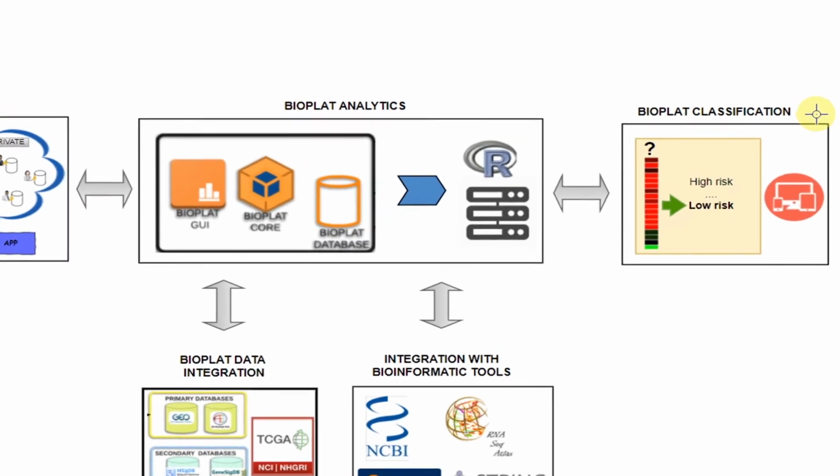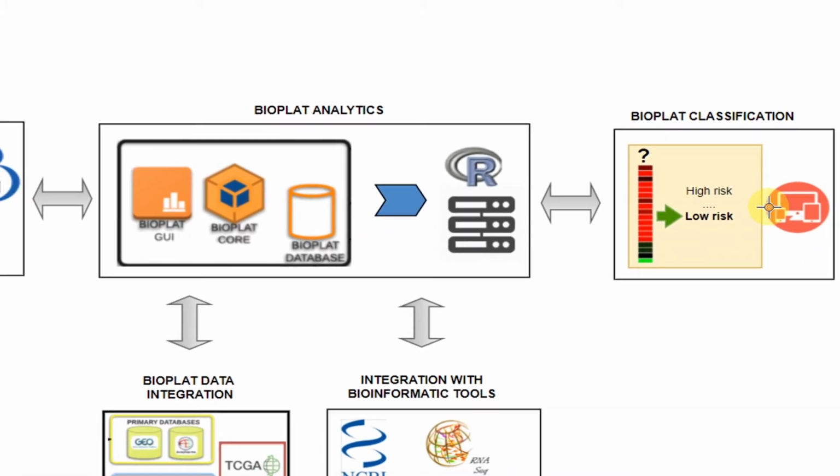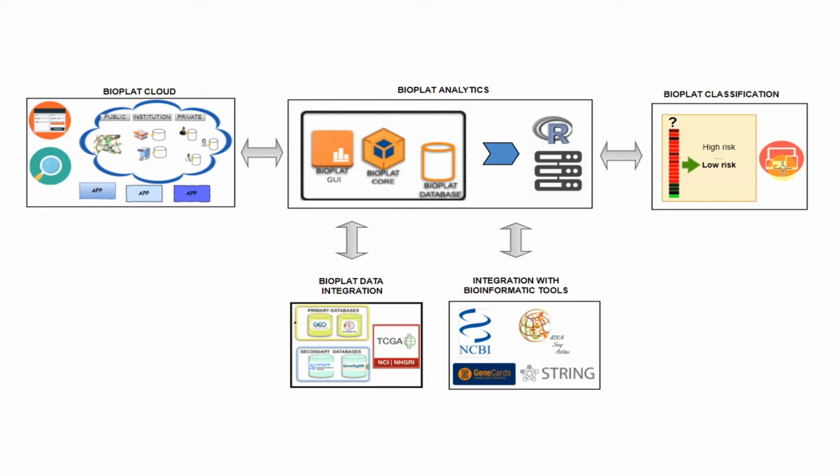Bioplat classification is an independent component that allows users to create classifiers from potential gene signatures identified using Bioplat. Then, users can classify new samples using either the Bioplat Analytics user interface or an independent classification web interface.